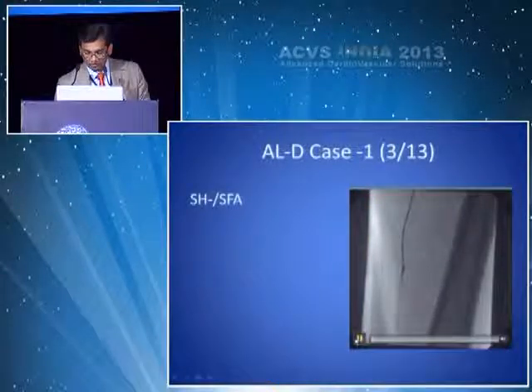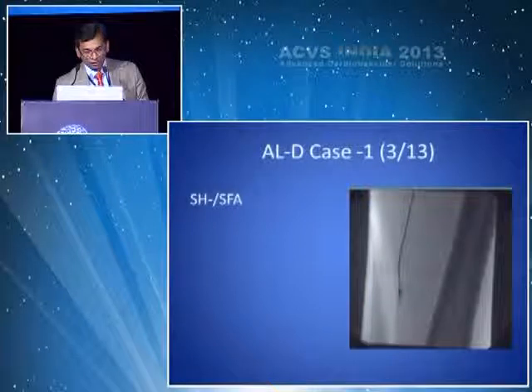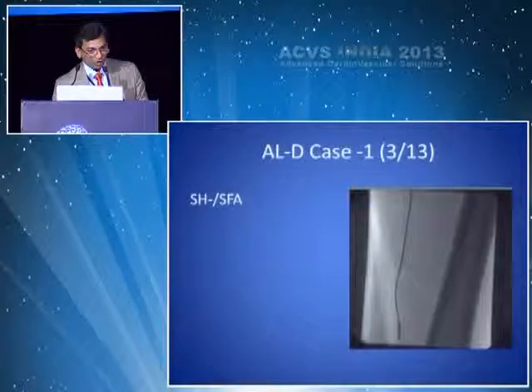Here is Silverhawk atherectomy of the distal SFA and popliteal using a mid-size cutting device. As you can see, you can cut around the calcium.